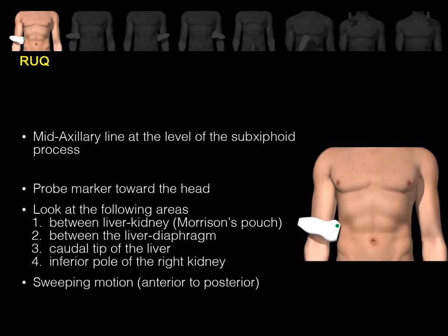The right upper quadrant view. Place the probe in the mid-axillary line at the level of the xiphoid process, keeping the marker towards the patient's head. The points of potential fluid accumulation are between the liver and the kidney — the Morrison's pouch — between the liver and the diaphragm, the caudal tip of the liver, and the inferior pole of the right kidney. Evaluate these areas using an anterior to posterior sweeping motion.